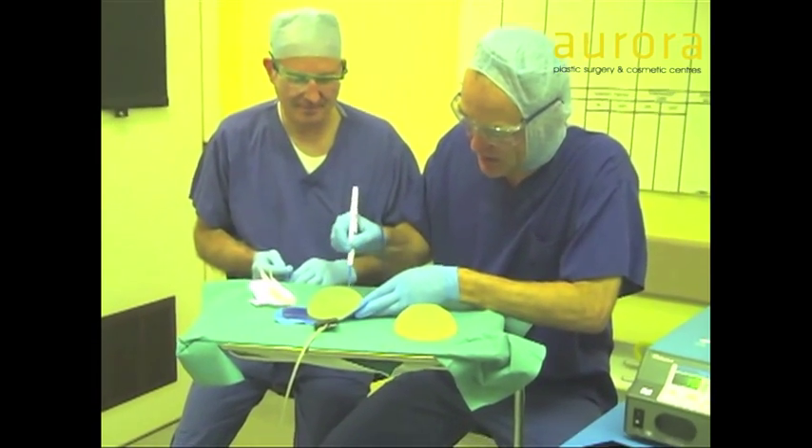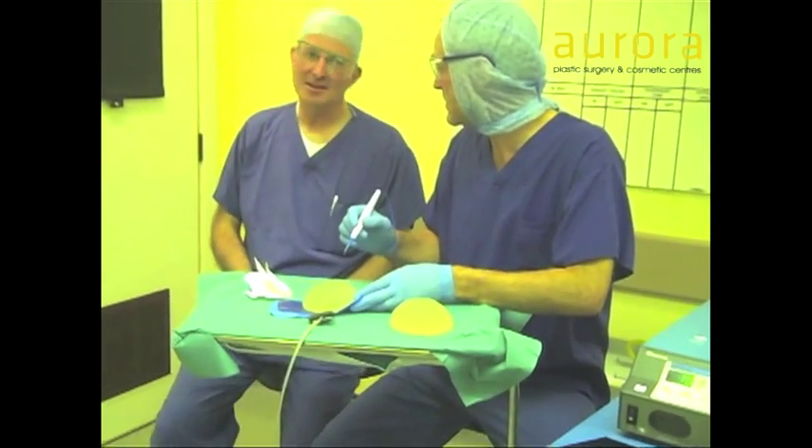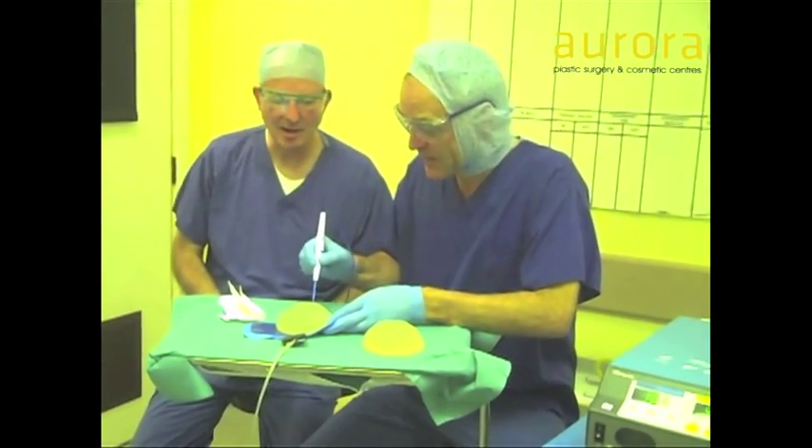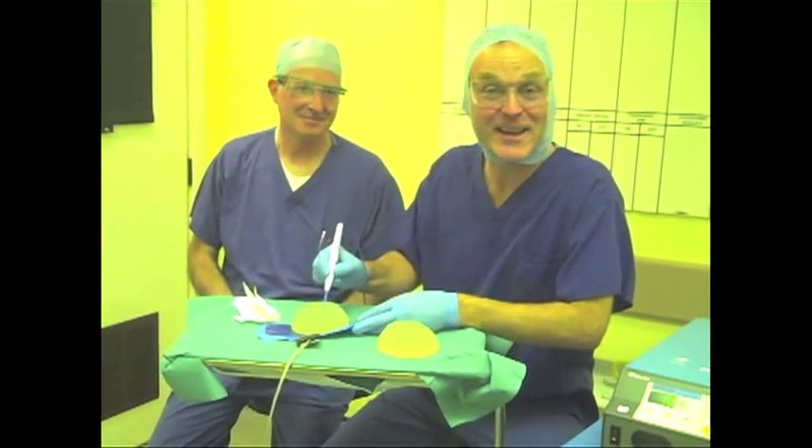You'll never damage an implant with a cutting diathermy. Because the melting point is what, Dave? 932 degrees Fahrenheit. And the incineration point? 584. Thanks, Dave. Thank you very much.